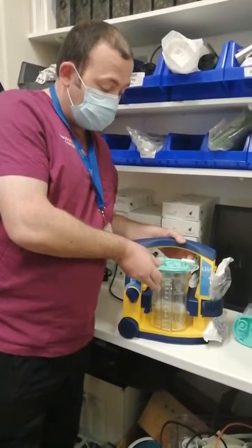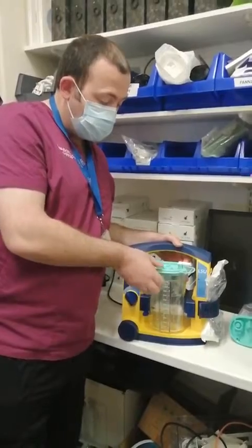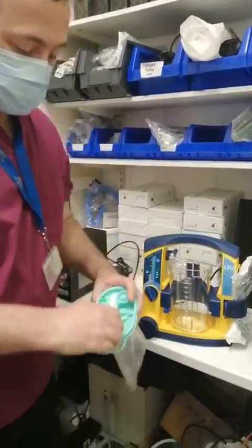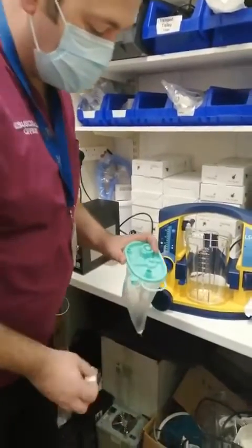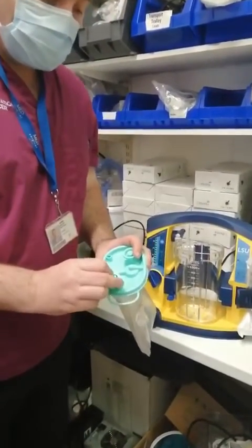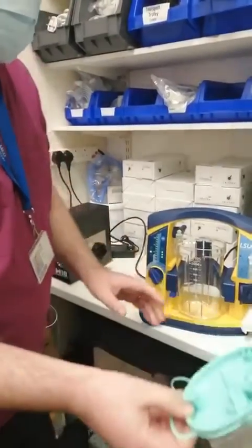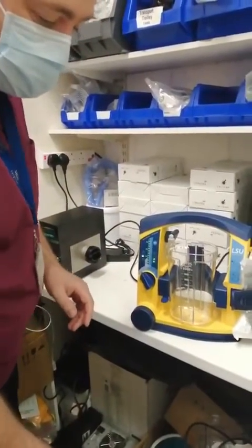A quick demonstration as to how to replace the liner on the LSU unit. You pull out the liner from the canister. You remove the white connector, which is disposed of in the clinical waste. You put the tab on top of the liner and this is also disposed of in the clinical waste.